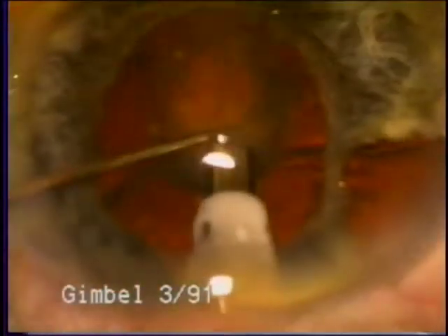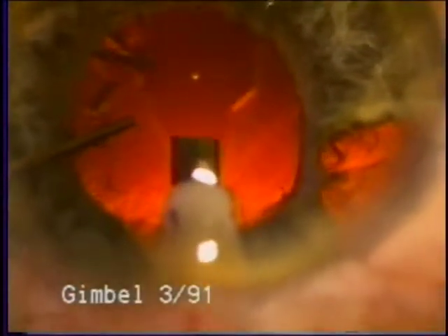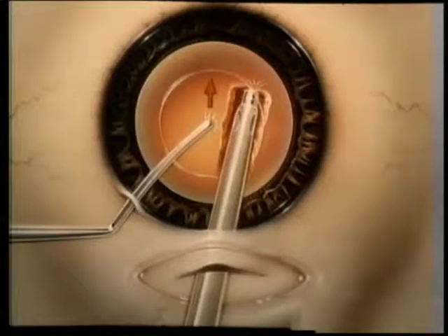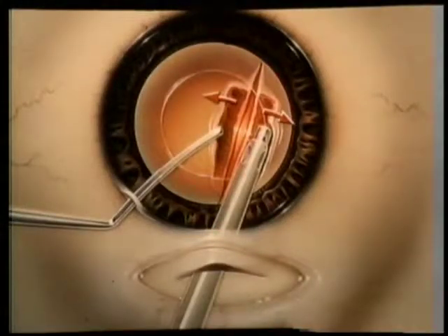Second instrument is used always to maneuver lens material to the tip. This artist view shows the downslope sculpting technique where the lens is stabilized and the initial sculpting often made a little to the right of center because the second instrument is stabilizing. And you see now in the cross section how the sculpting is done in the upper portion of the lens, down the slope of the concavity of the posterior capsule.